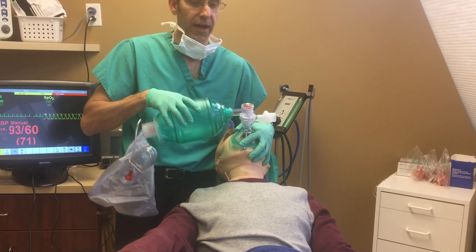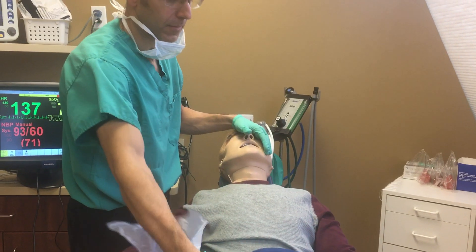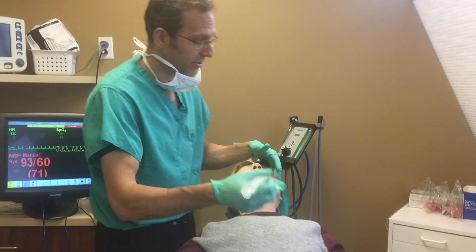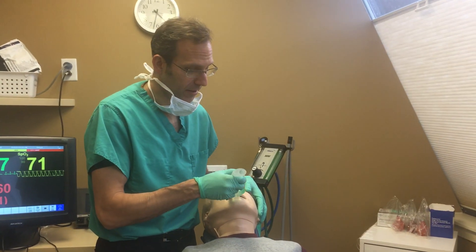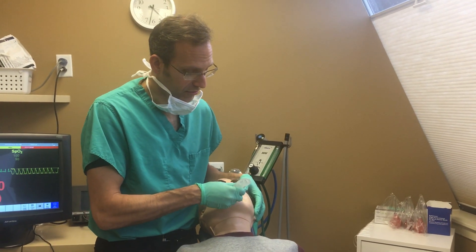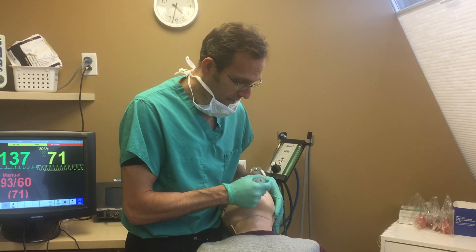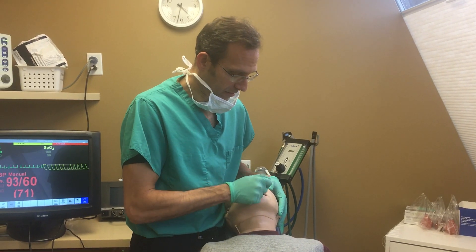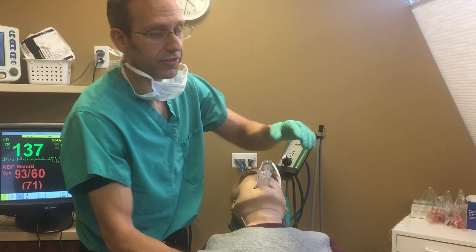I want the i-gel here. I've got my i-gel. No need for laryngoscopy — I'm just going to place it directly into the patient's mouth, past the patient's tongue, and get it fully seated.